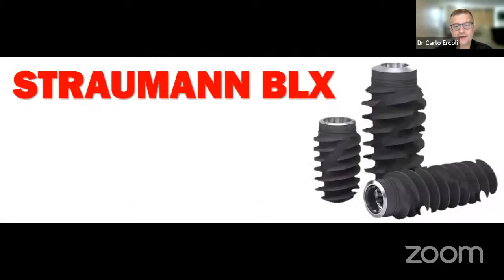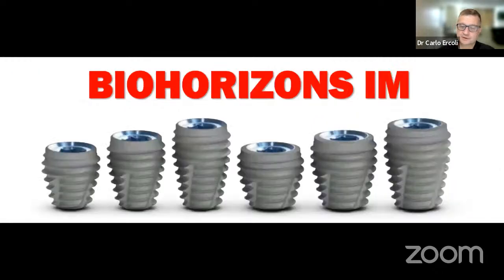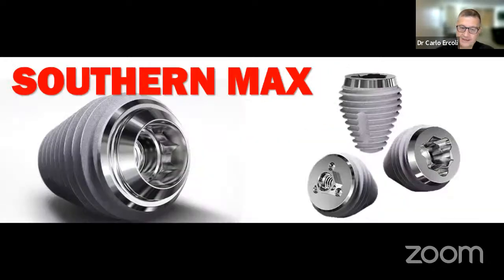But of course, when you do that, you can't just place an implant that's 4 or 5 millimeters in diameter, because the socket is actually wider in both buccolingual and mesiodistal direction. So you have to think about some larger implants, some 6, 7, or 8 millimeter implant, which of course are present on the market. We often use either this BioHorizons or the Straumann implant, but in your continent, Southern Implant, based out of South Africa, makes this wonderful implant that can actually fill the socket and can achieve exactly the same type of result.